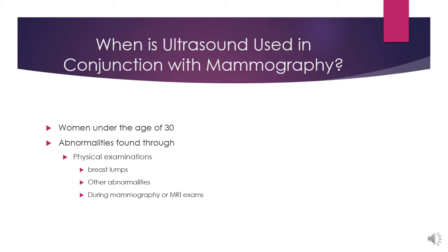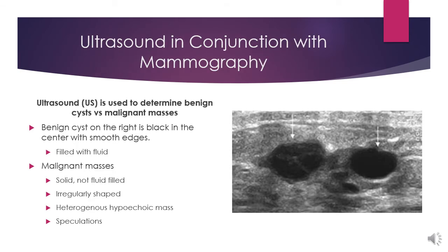Again, it's also used in conjunction with an abnormal mammogram. They might be sent for an ultrasound also because it is able to see different things in the breast than a mammogram can.